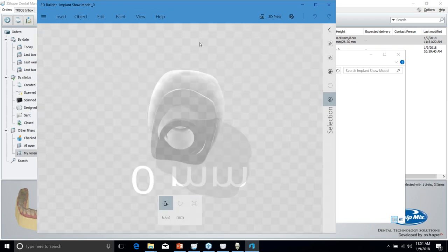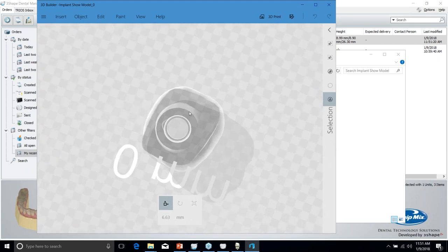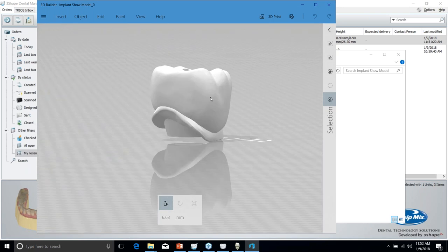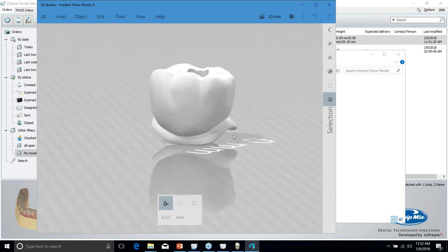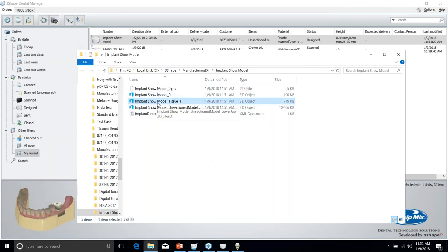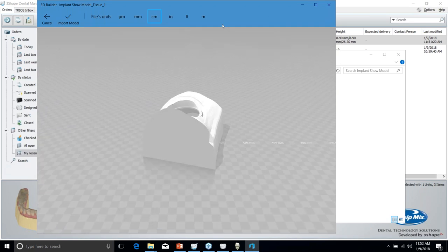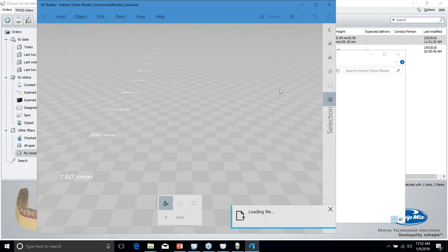And you can see it has the indexed portion cut into it. You've got your tissue, the emergence profile of that implant, and then your crown with the screw hole all the way through. So you can mill that in-house. Next, we have the tissue piece, which is our separate soft tissue for the model. And then you have your model.